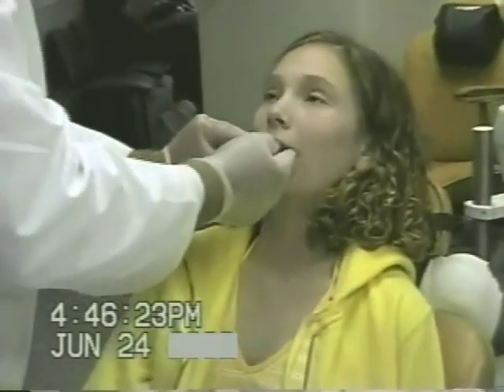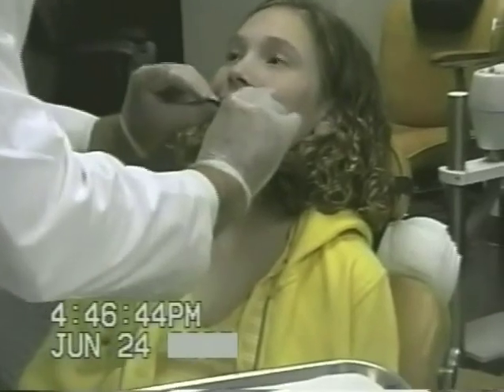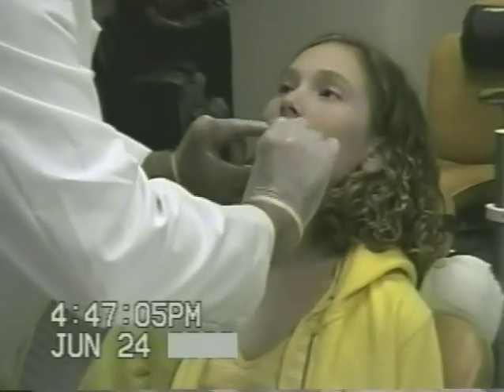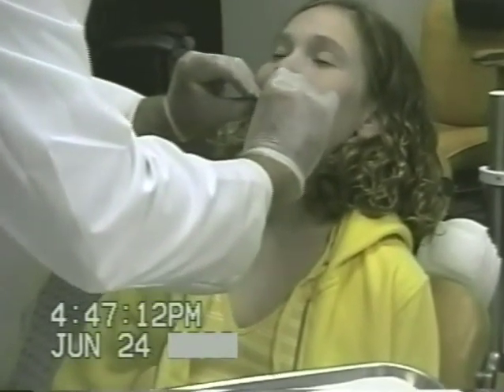I am now adjusting the lower appliance to the upper so that they both fit in harmony with each other. I'm using carbon paper to detect any high spots on the lower appliance that putting in the upper appliance may have caused. And I just use a drill to rebalance the appliance so that it hits simultaneously in time and in pressure on both the left and the right sides. I usually do this 2 or 3 times.